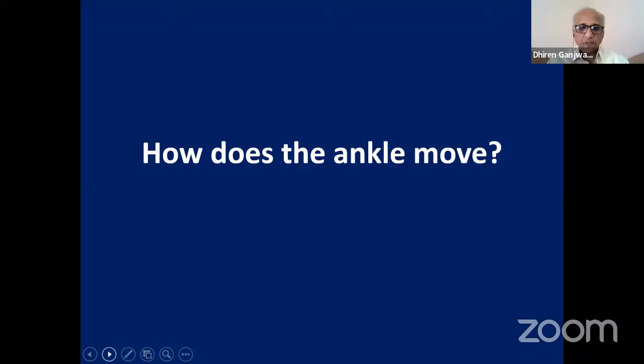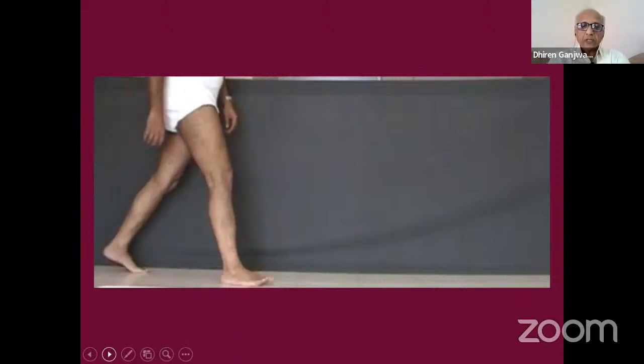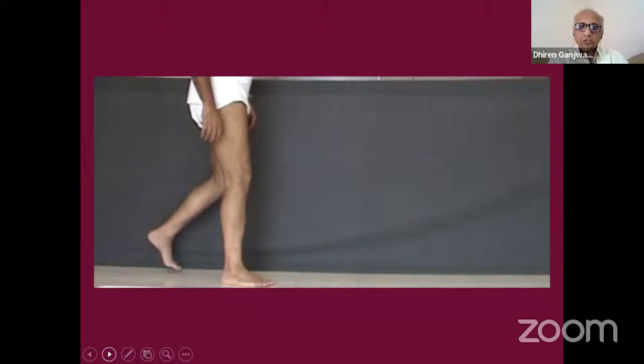On the right side of the lower leg. So it starts with the heel strike, and this is how it moves forward. Focus on the ankle only.